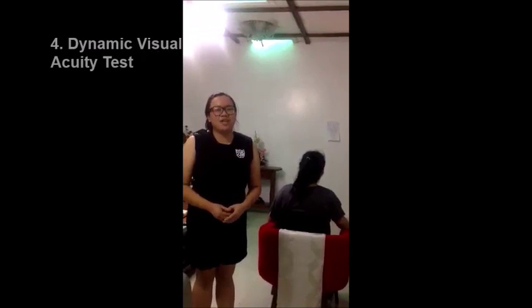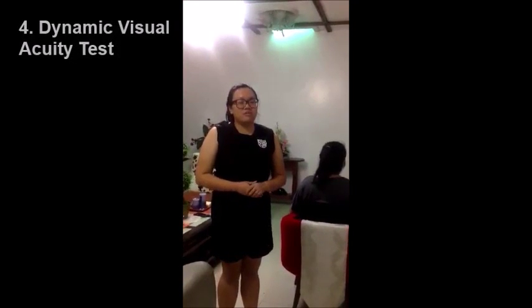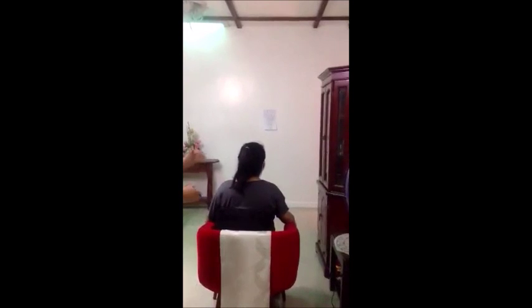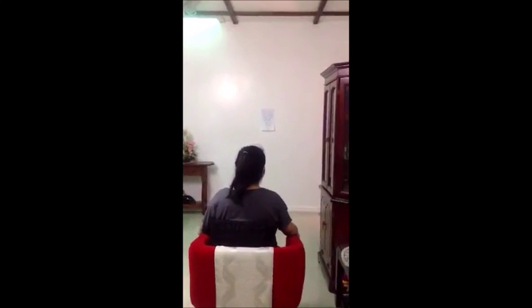The dynamic visual acuity test is used to test for vestibular hypofunction. To perform this test, ask the patient to sit 10 feet away from the Snellen chart. Ask the patient to read the lowest and clearest line possible. That is the static visual acuity test.